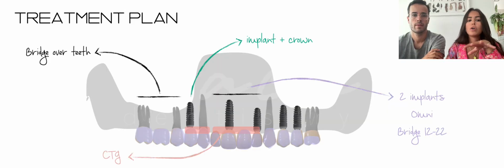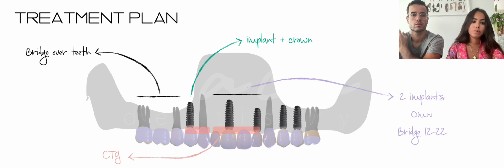Here you can have a more detailed overview of the treatment plan we proposed to the patient. We decided to maintain the implants that she already had on the second quadrant, as they did not show any sign of infection. Only the crowns were replaced. For the anterior bridge, we decided to use the OMNIs as the intermediate prosthetic component due to their smaller width compared with the multi-units.